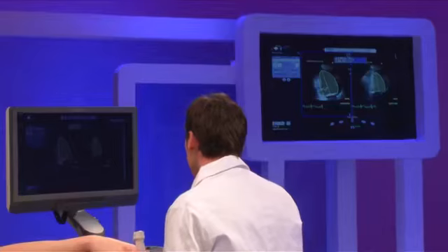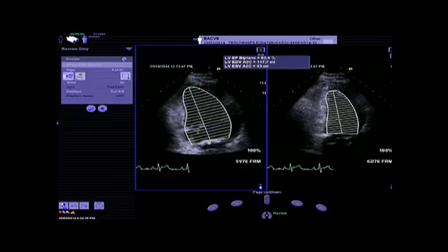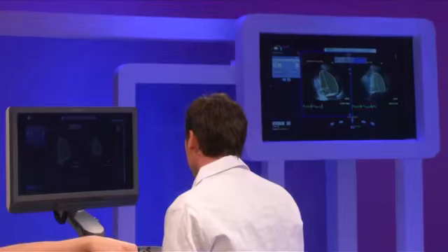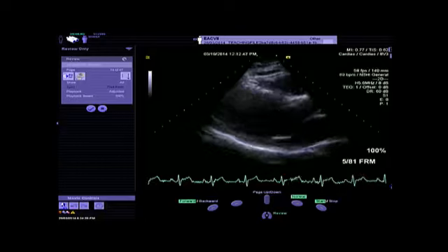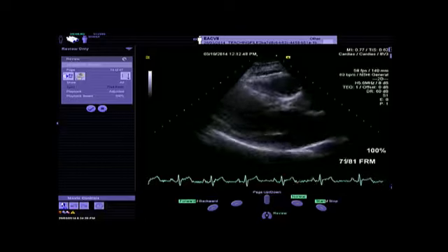So now, just to show you the measurement of the mitral annulus diameter, which is very important in these patients, I will try to pick up the images regarding the parasternal long axis view and show you how to measure these parameters. So let me take the image that we recorded. And here you have your parasternal long axis view. And what you need to do is just the measurement.